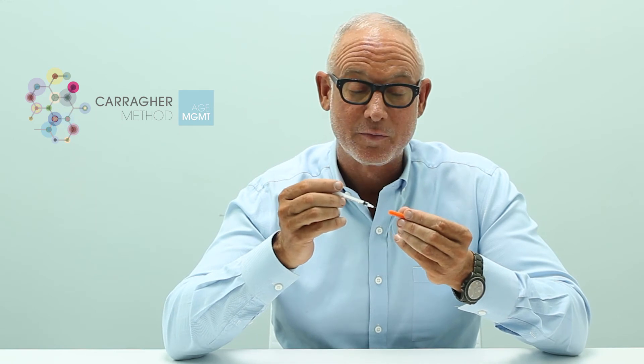Now that your injection is done, you're going to want to dispose of your needle. I don't recommend recapping needles because there's always a risk of stabbing yourself if you do that. You're going to want to discard the needle in your sharps container, which either you've been provided with when you picked up the medication, or you can pick one up at a local pharmacy.